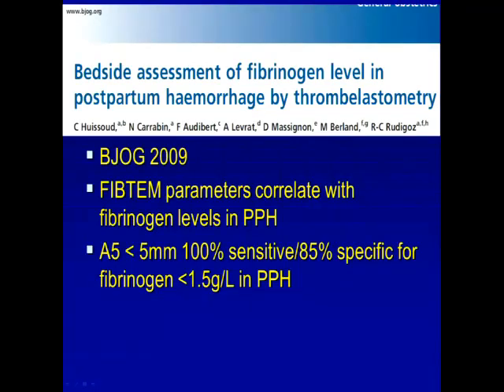With regard to the platelet function, that is one topic. We purchased these things from Rotem, and then they said at the last minute that we can't use them in North America, so we went back to the PlateletWorks people and talked to Jackie, and that's what they wanted to use. There are 4 or 5 different platelet function tests, machines, and modalities that you can use, and we will be bringing that.